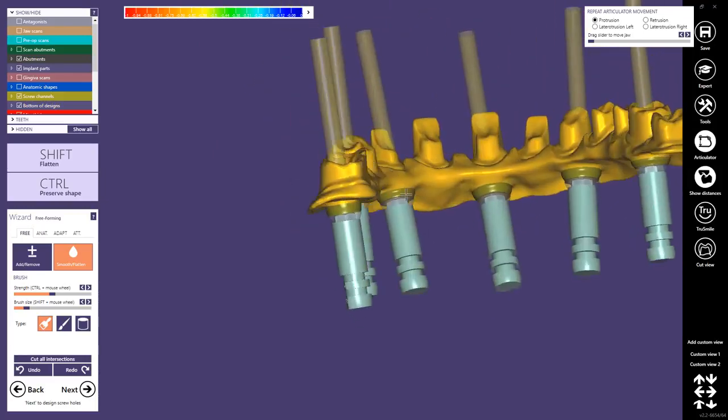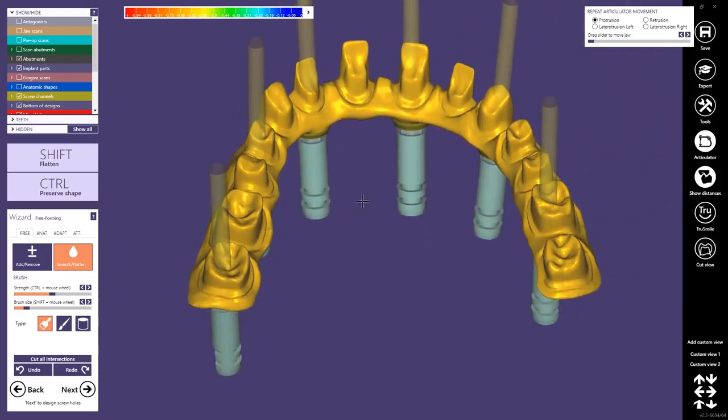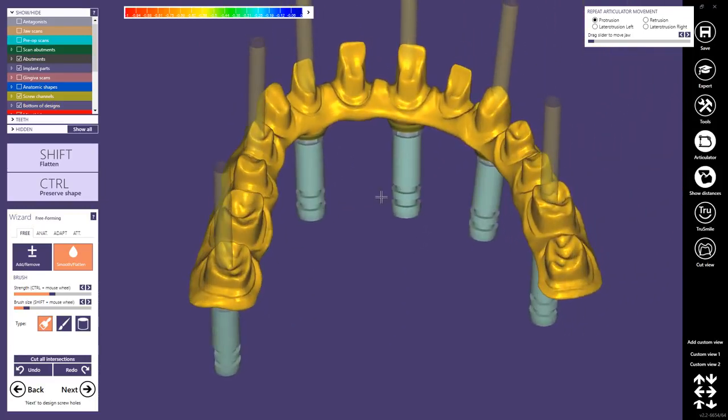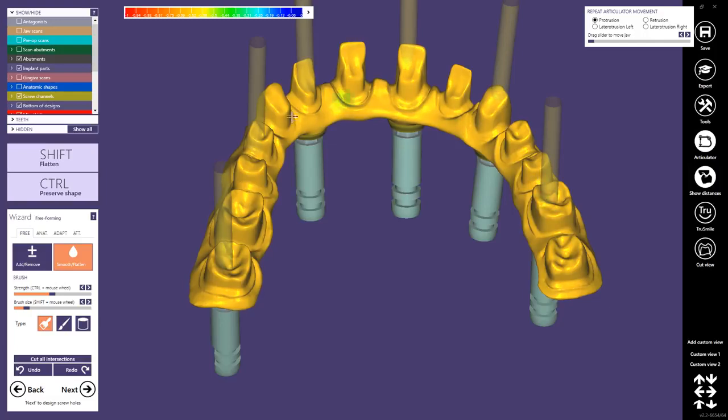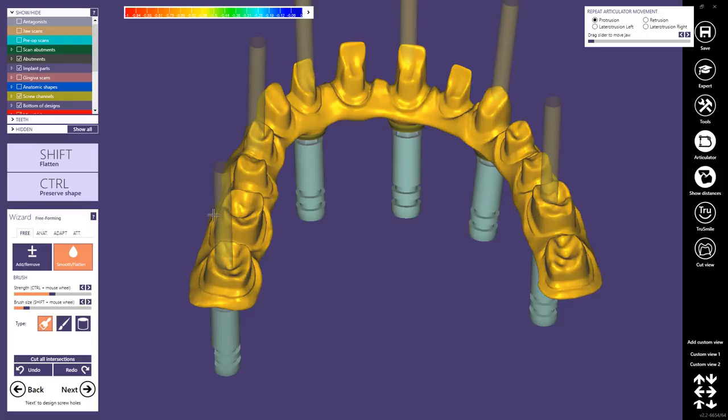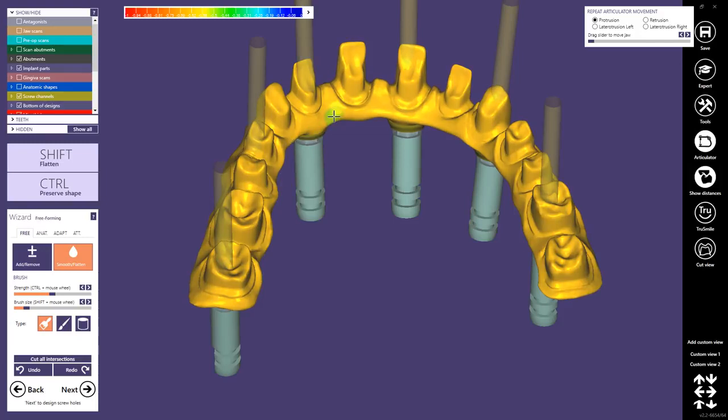Now before I proceed and before I finish the restoration and before I export it with the screw channels, I will save this framework as an STL. This is now a workaround and I will use it in a second step as a JAWS scan to create the secondary crowns on it. It's very important to save it manually now for two reasons. The first reason is the screw channels have not been created yet and if you save it manually, the restoration will be saved in the orientation of the scan data. But before I do that, I usually go to the DentalDB before, then I duplicate the case and check also the scan data.